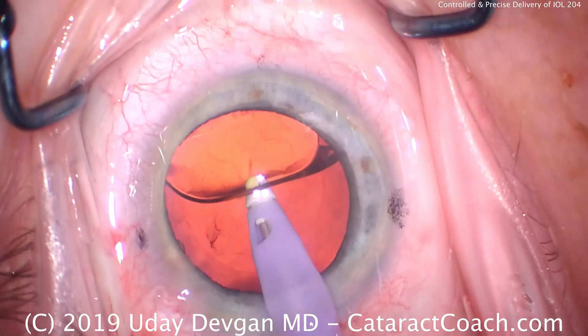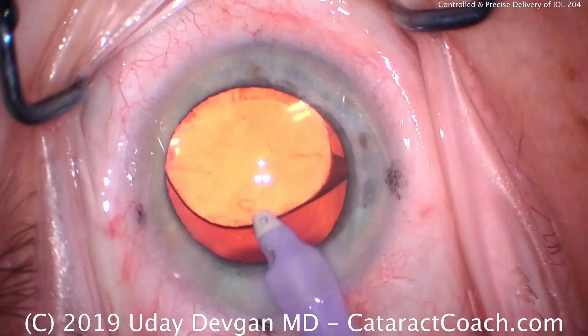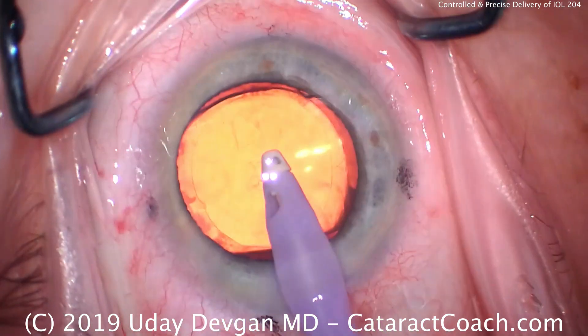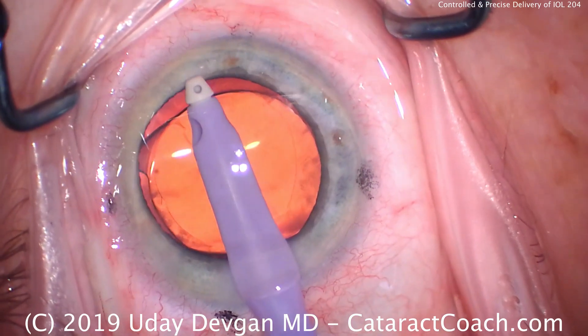We've had many videos of misloaded IOLs and issues with that — this is how it should be. Beautifully loaded, and then we have a very controlled and precise delivery of the lens. And that's the best.